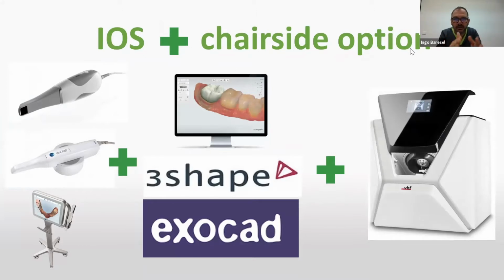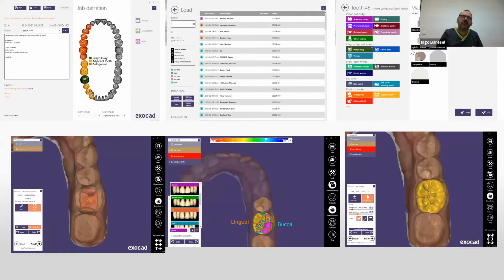For sure, there is now the CEREC system missing, because everybody knows it, and CEREC is one of the greatest systems for chairside dentistry. But even with the other scanners, you can now do chairside work. How does it work? You have so many options. You send the scan from the scanner directly to the designing software. You import it. You can choose whatever you like to, material thickness, all the options. You are open to change as you like to.